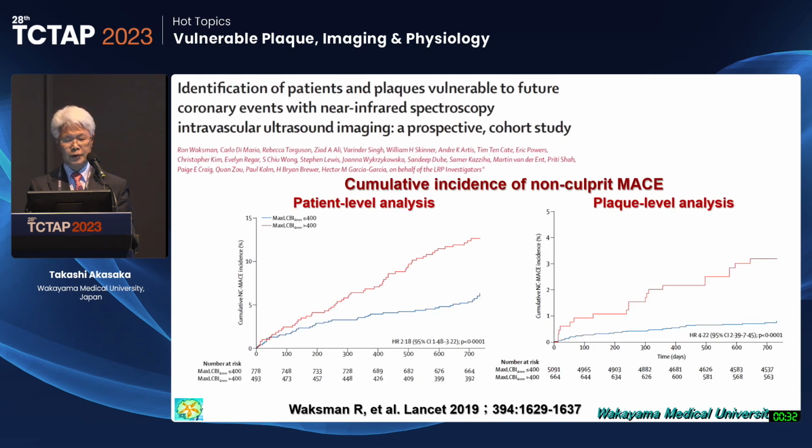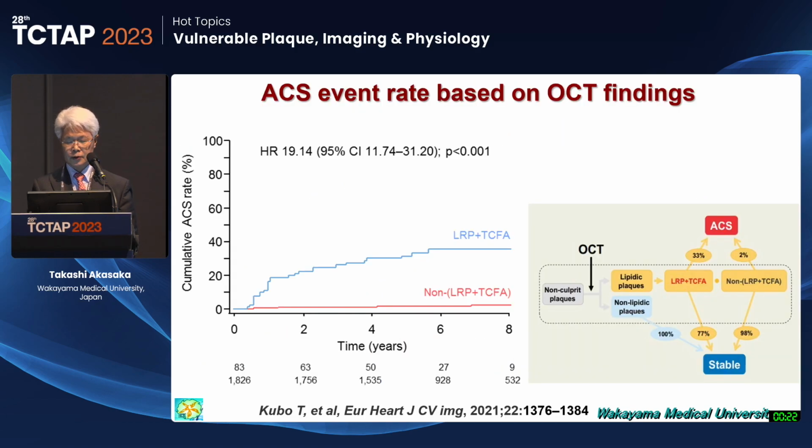And as you know very well, the LRP study demonstrated a high predictive value for future events if the max LCBI is more than 400. And this was also already demonstrated by Dr. Finn. This is our data published by Dr.